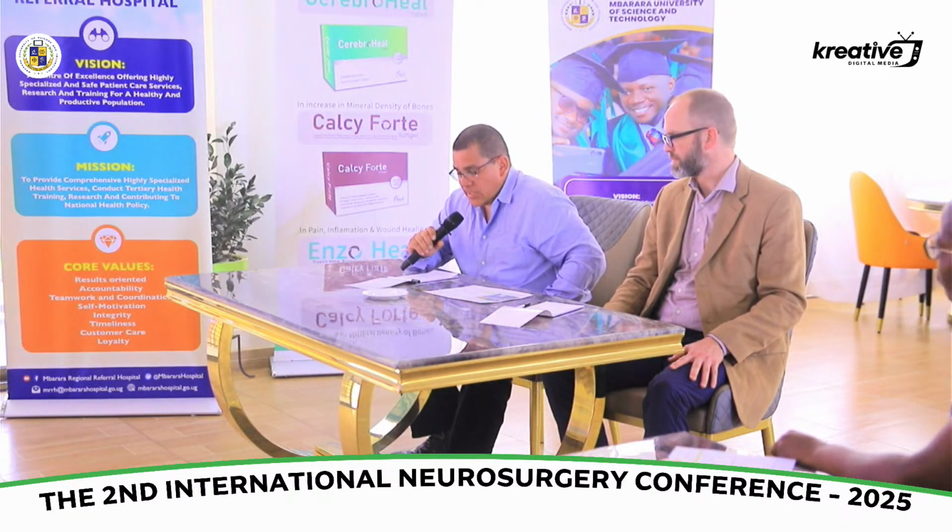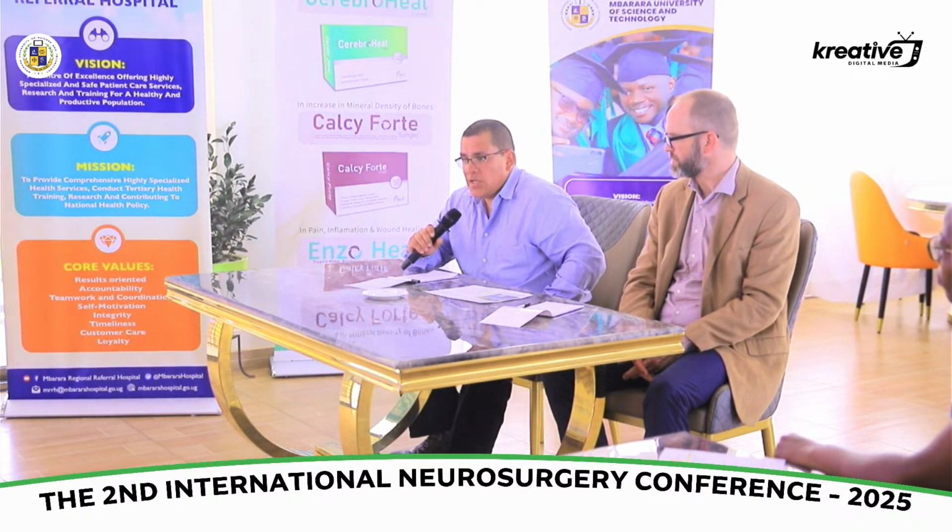As far as the Spencer's curve goes, it's just a physics that was initially published to support the use of TCDs as an indirect surrogate of cerebral blood flow. And basically, it shows that the smaller the diameter of the blood vessel is, the higher the velocity is going to be. But there is going to be a point in which the velocity is going to go to zero because there is no more blood going through that blood vessel.